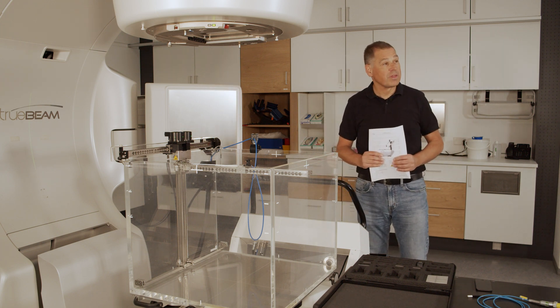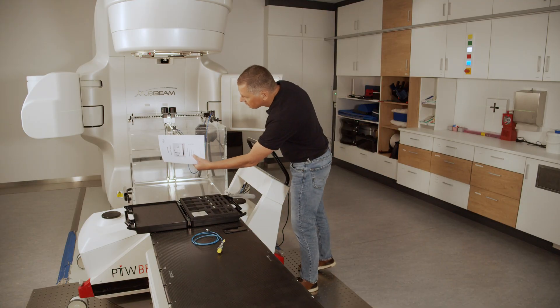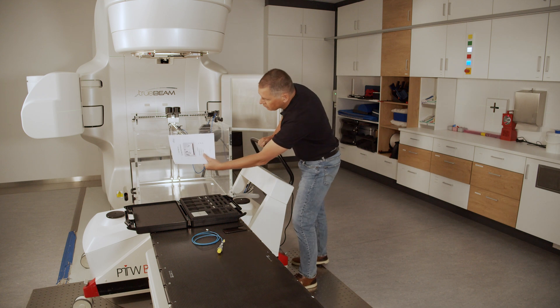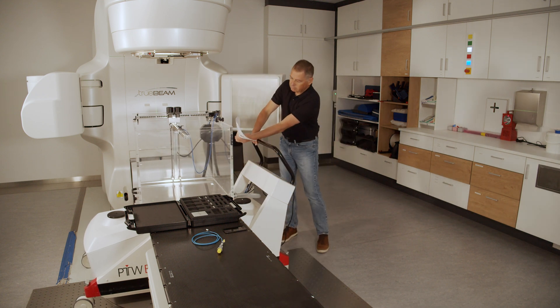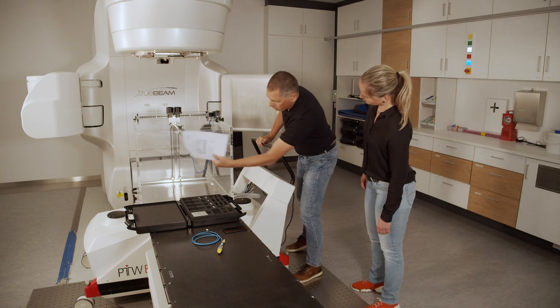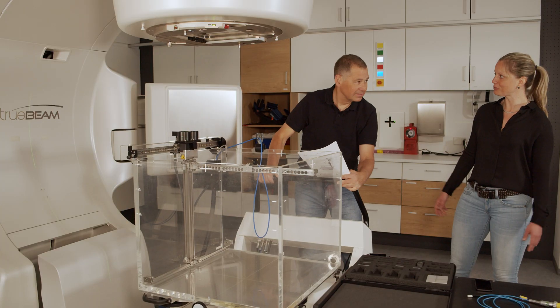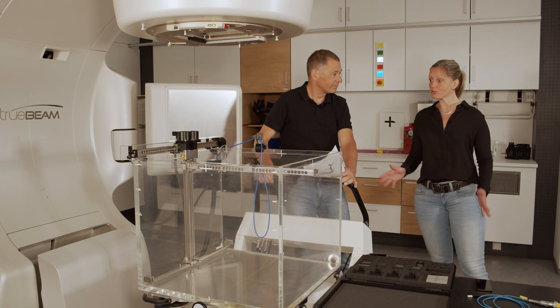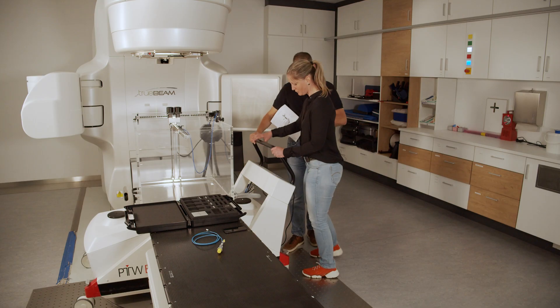What a nice water phantom. It will hardly differ from the others I used before. Seems the exact positioning is already taking some time. But he's lucky — his friendly colleague is also on shift today. What are you doing? This is a BeamScan. You don't need to position it exactly. Just roughly is fine. Let BeamScan do the work for you.